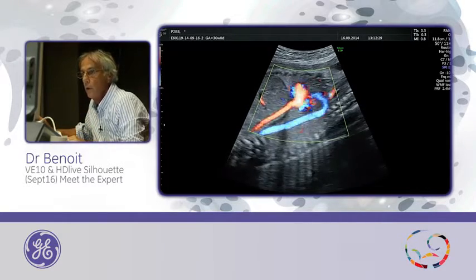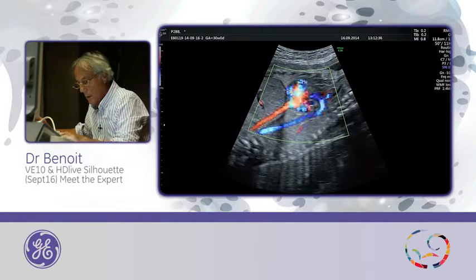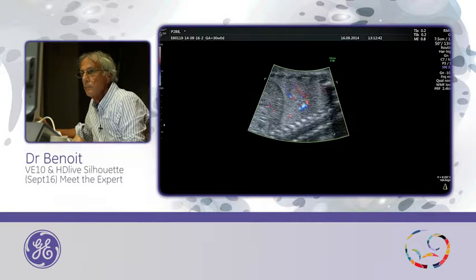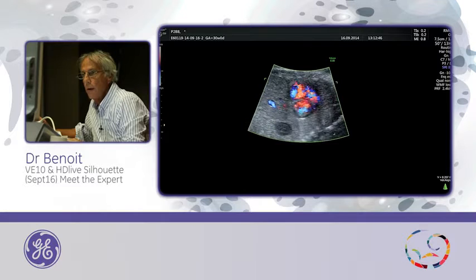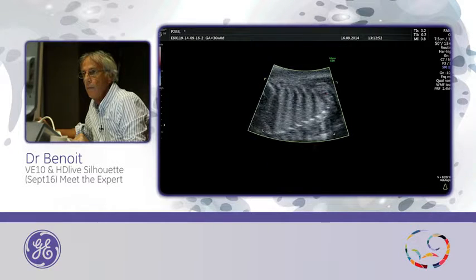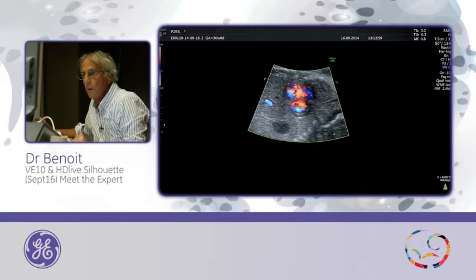So this is the aortic arch. Acquisition with 3D. The baby moves, so I will do another one. Okay, this one is better.